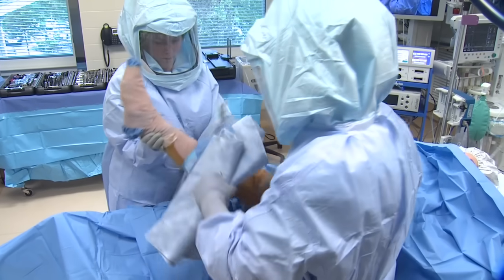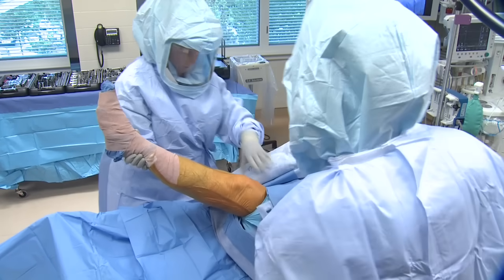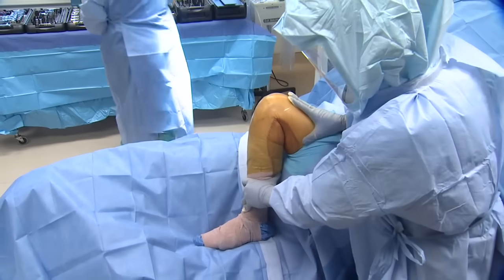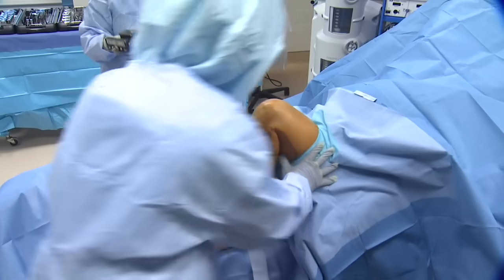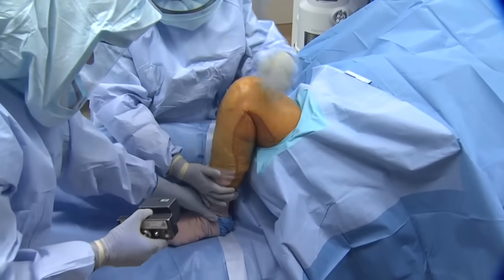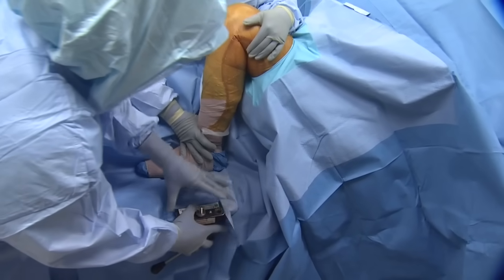After the left knee is prepped and draped in the usual sterile fashion, an extremity drape is placed. The left knee is brought into full flexion to completely remove any additional slack in the drapes themselves. This is to facilitate appropriate placement of the DeMaio.